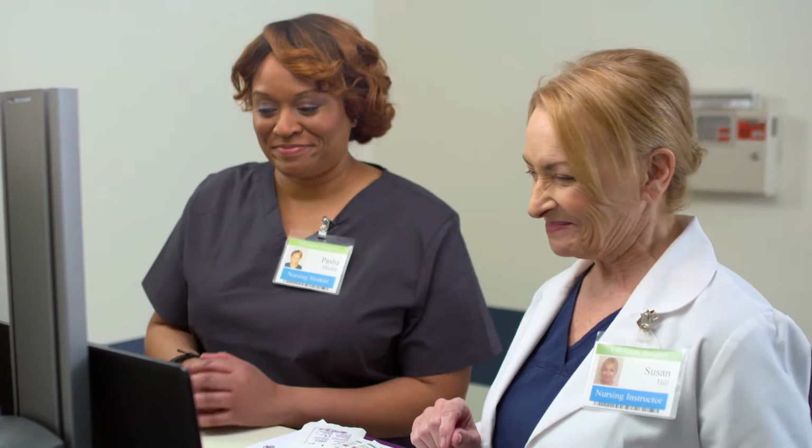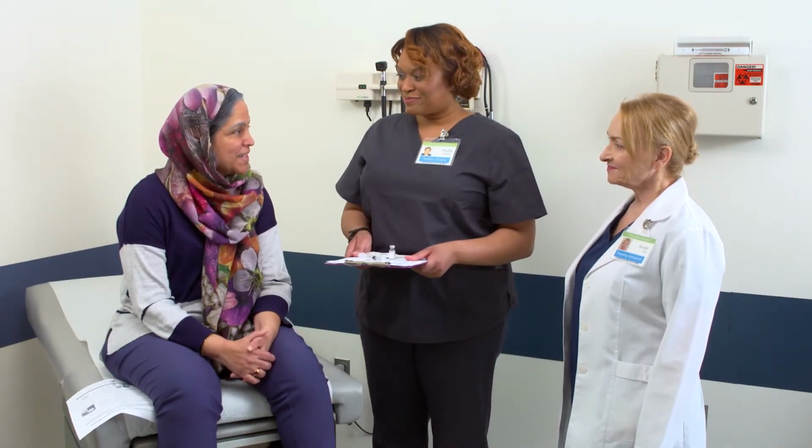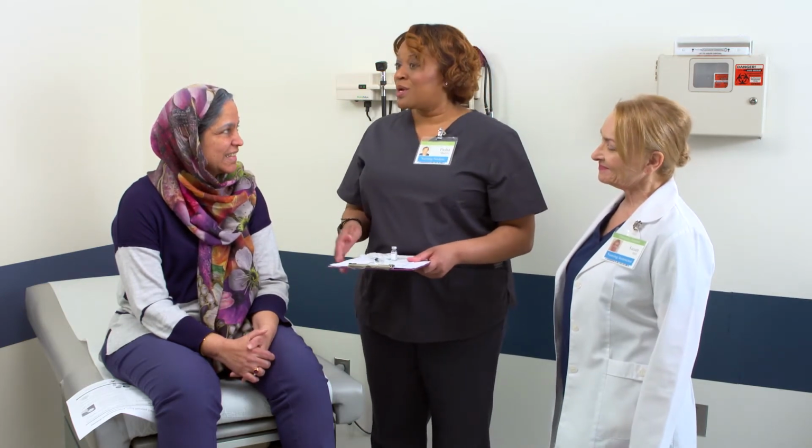Okay. Hi, Mrs. Khan. We're back. Hi, Pasha, Ms. Hill. Hi, Mrs. Khan. As we discussed a few minutes ago, I'm here to give you your pneumococcal pneumonia vaccine. It lowers your risk of getting a certain kind of pneumonia. The vaccine is recommended for people over the age of 65. I have the consent form you signed right here.